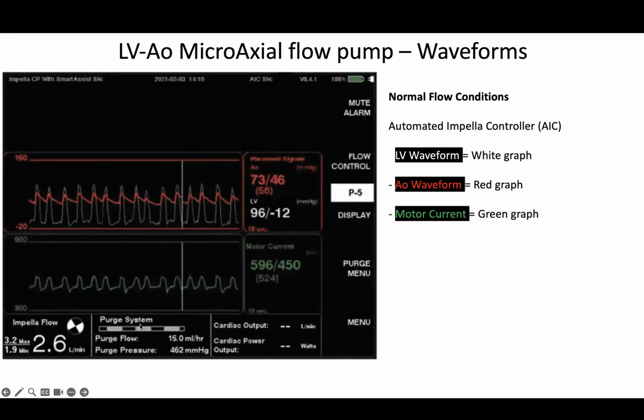And then the purge, what's the purge for? To keep the system clean, like from rusting or just the impeller, and maybe? No, not really. Anybody?